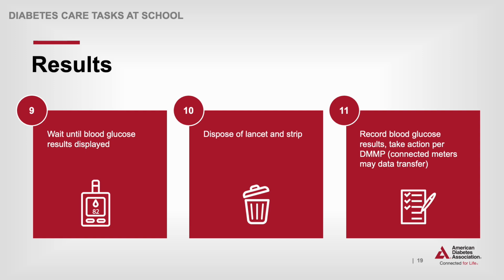Blood glucose monitoring does not present a danger to other students or staff members when there is a plan for proper disposal of lancets and other materials that come in contact with blood. The school health team should agree on the plan, which should be consistent with standard precautions and local waste disposal laws.